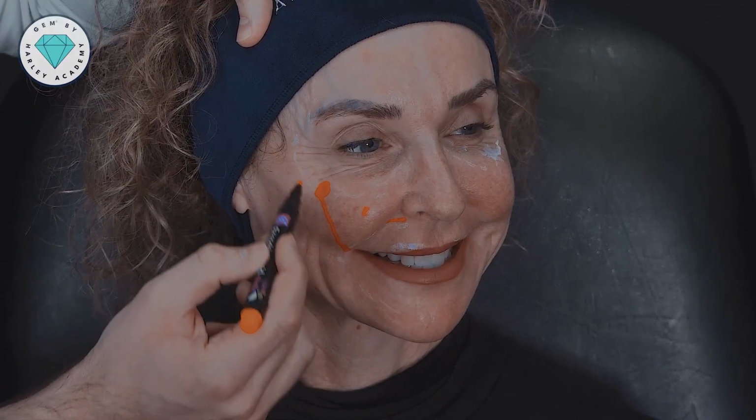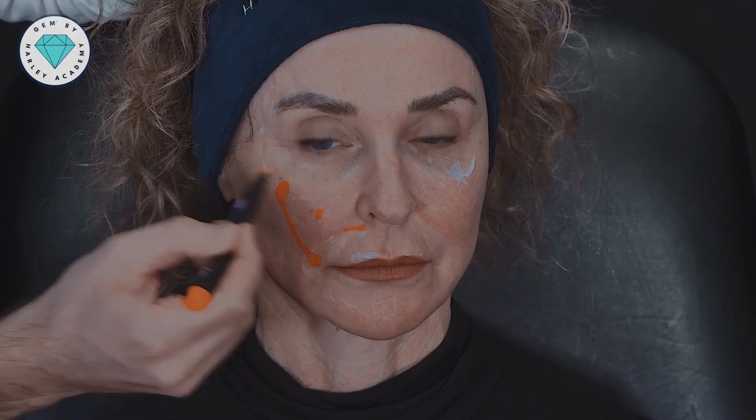So we get these quite dramatic contours throughout the face, which, in combination with a little bit of displacement of filler under the eye, is really what we should be picking up on as injectors, something we would like to naturalize. My treatment plan is multi-stage, but today's focus is to reset back to baseline by focusing on these commonly mistreated areas to avoid filler displacement. First, we're going to use an ultrasound to see if we can visualize some of the deep volume in the medial cheek.